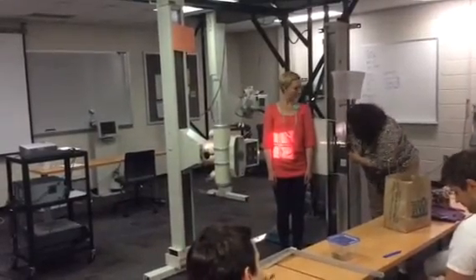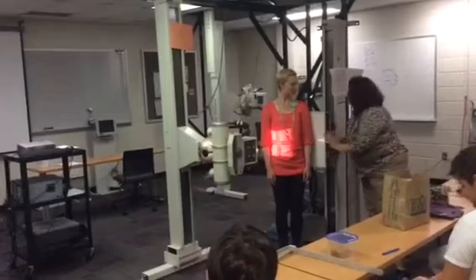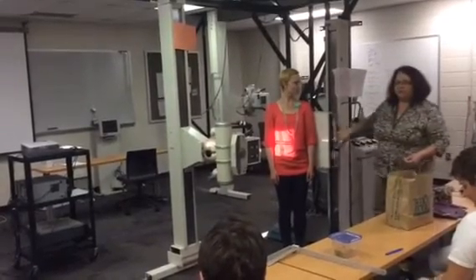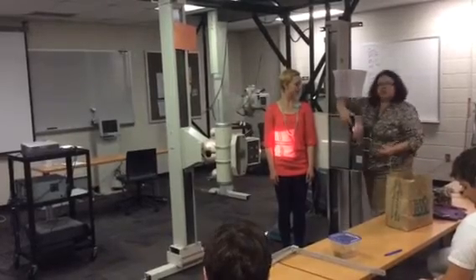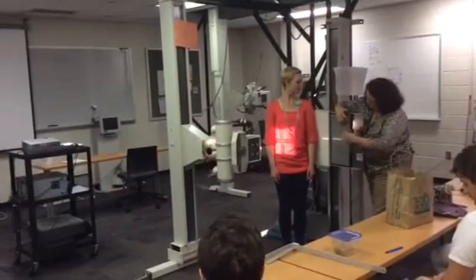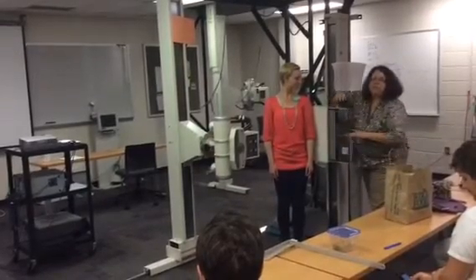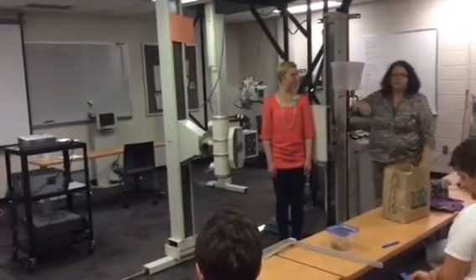Make sure your central ray is in the middle of your film. And then mark your film. I've got 11 by 14 field. That means I've got about 2 inches border on the side here. So I'm going to measure in a couple inches and put my marker right directly on the film there. And I'll be in the field. Okay?